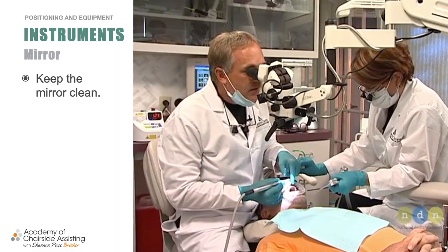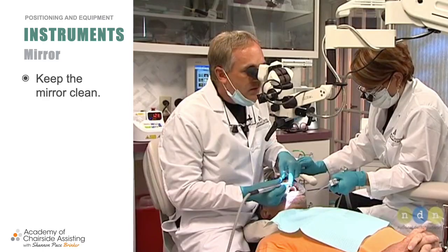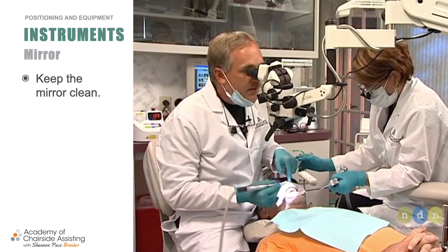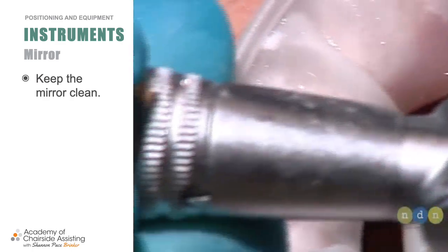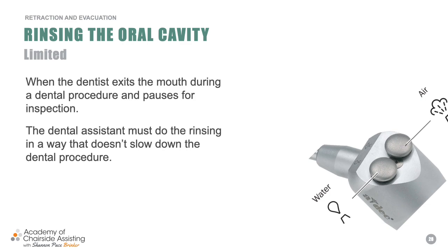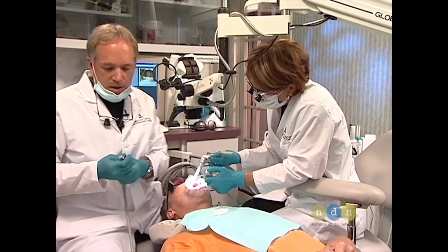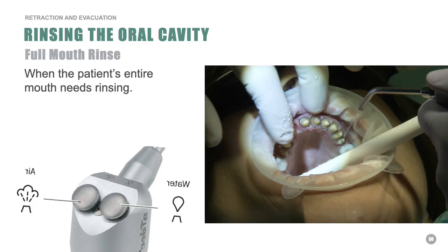Now watch me. You see here, I'm going to go straight to that mirror because he's always holding that in the left hand if he's a right-handed dentist. What did I do? I wiped that mirror. Let me back up a little bit. I want you to see that again, okay? Look what I did. You see me? I'm coming back. I'm going to wipe that mirror real quick. Watch. You see it? You didn't even see it, right? You got that? It was so fast. These things are going to come. It's almost like you guys are doing a dance, right? You're doing a dance. Let's hit the edge. See? Now. Getting in there, getting out, all right?